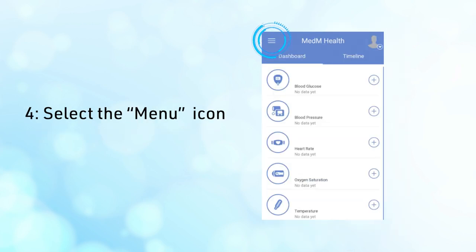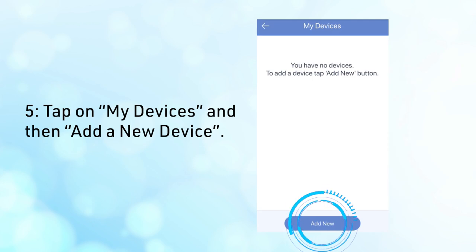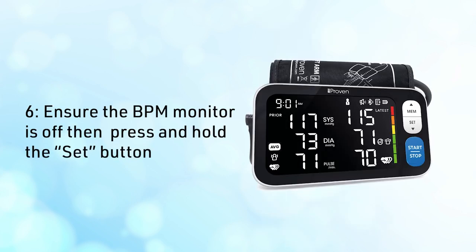Fourth, go to the left corner and select the menu icon. Fifth, tap on My Devices and then add a new device. Sixth, ensure the BPM monitor is off. Then press and hold the Set button. After that, the Bluetooth symbol will flash on the BPM. The device should show in the Bluetooth settings — connect to it.